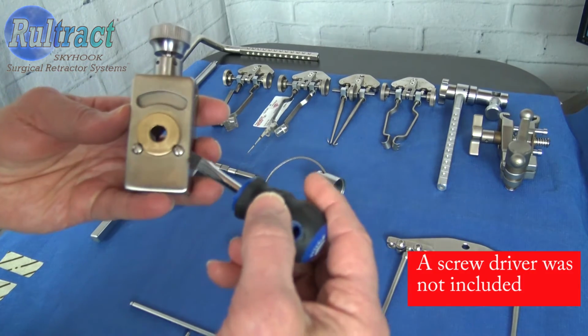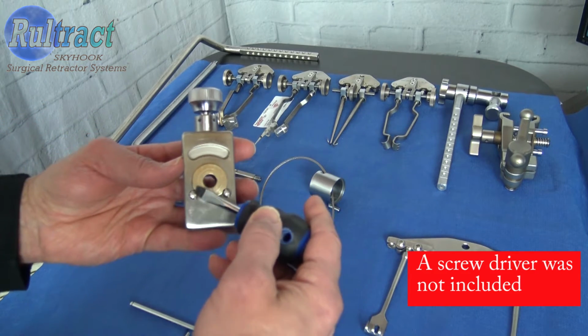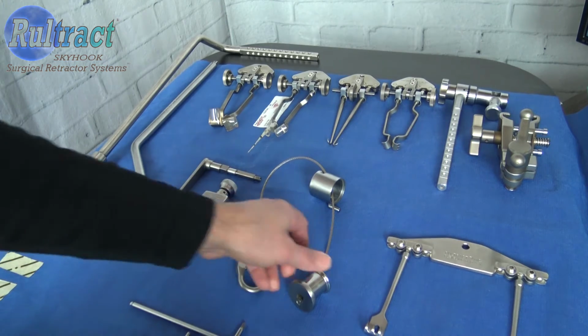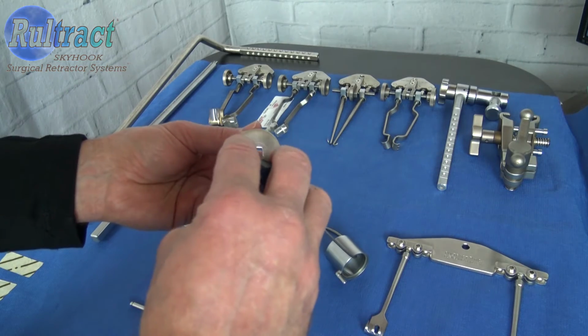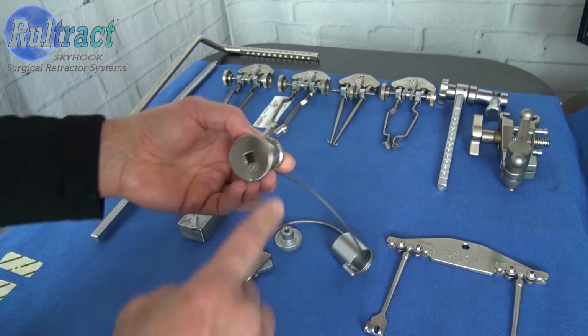Next, using a flathead screwdriver, check your ratchet cover plate screws. Then, using a flathead screwdriver, check your cable access plate screw. Go ahead and make sure that that's tight, and then run your finger over it to make sure that it sits flush.